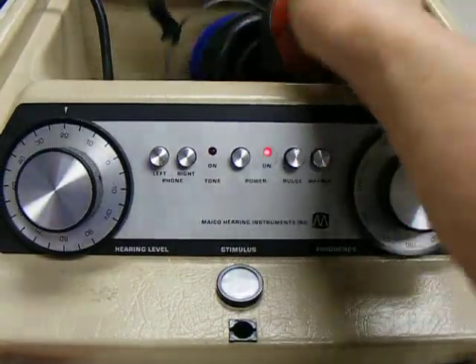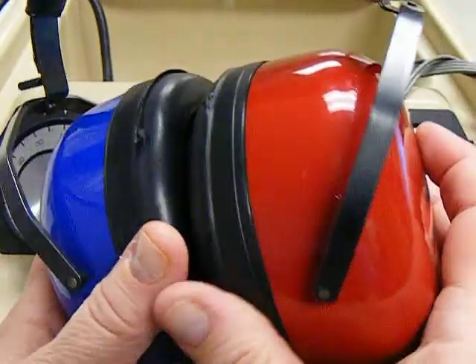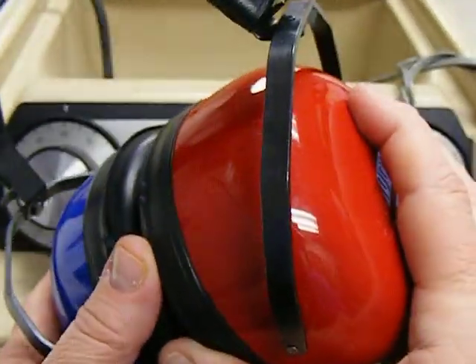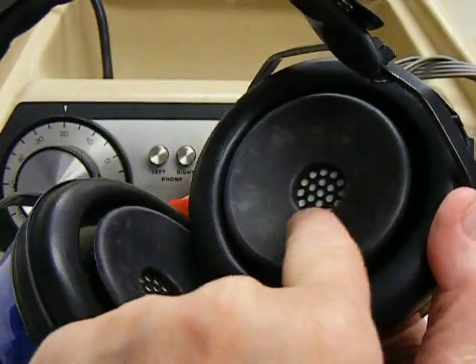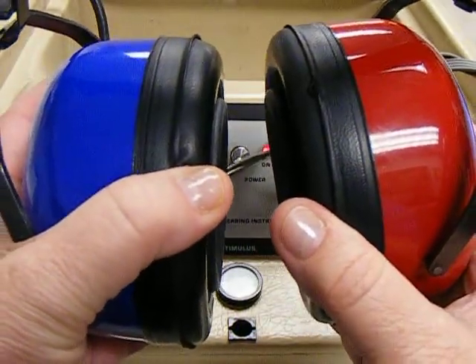These are the earphones that come with most of our audiometers. They're double cups — they have an earphone inside of a protective cup that helps eliminate some of the background noise. Earphone placement is crucial. You'll want to put the center of the earphone directly over the opening of the student's ear.